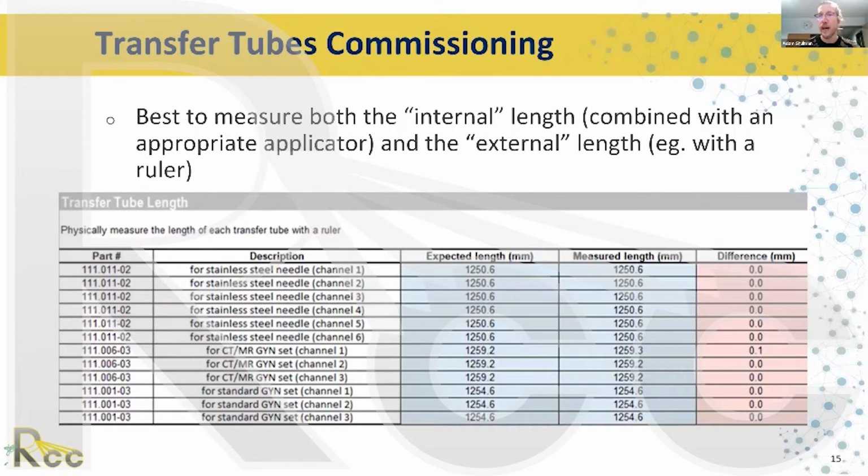at that point, you then measure with the manufacturer length guide, whatever sort of tool that is. And depending on the situation, for example, if you've got a Nucletron system, which I'm using right now, sometimes there's some wiggle room. Or if I'm measuring a curved tandem that has some space inside, or a ring or something like that, the length that I measure is a little bit dependent on how hard I press. And especially if it's a ring, I can press it and really make it bow out, and I can get some different measurements. So one of the main things that I look for, depending on the system, is consistency.